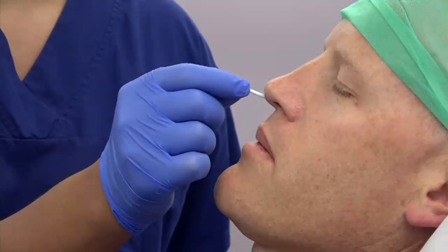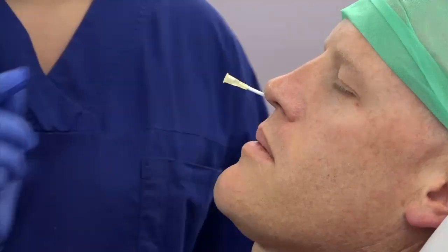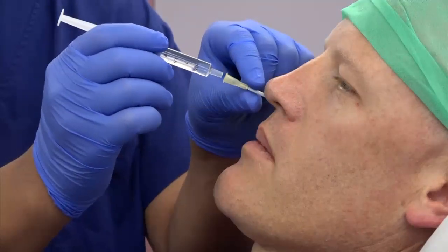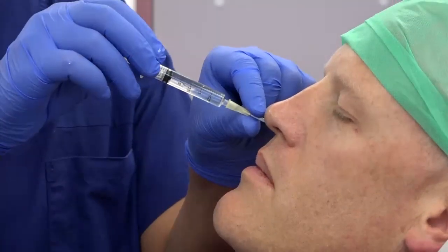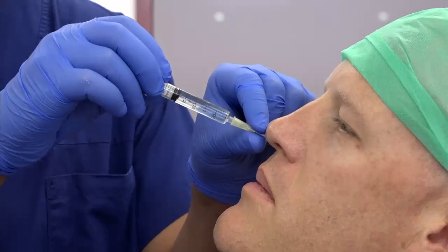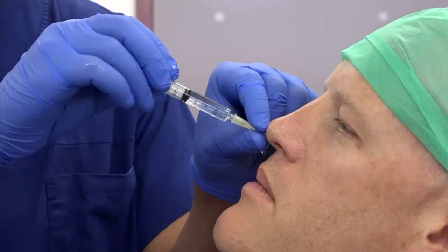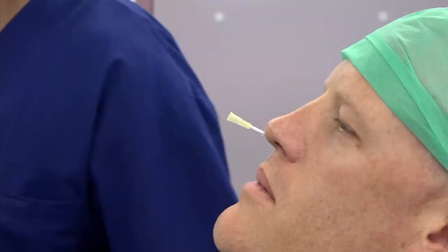Before injecting local anaesthetic ensure that you are against the posterior nasopharyngeal wall. Slowly inject the local anaesthetic through the swab; small amounts of local anaesthetic will leak out. You can repeat this every 5 minutes, leaving in the cotton tip swabs for 30 minutes, and then remove.